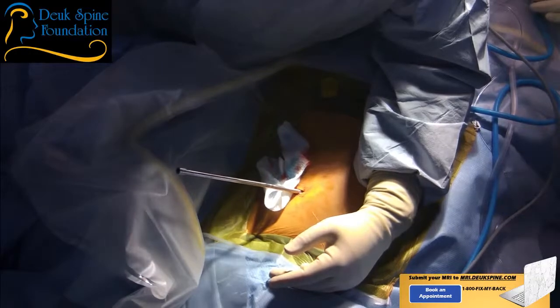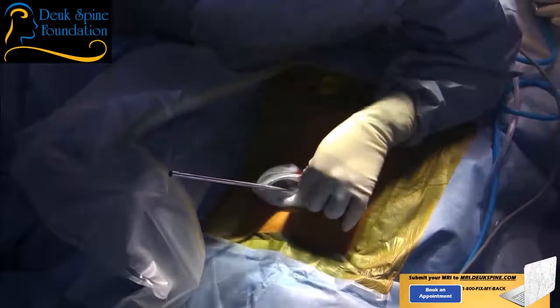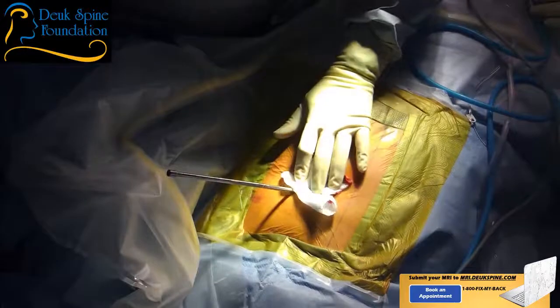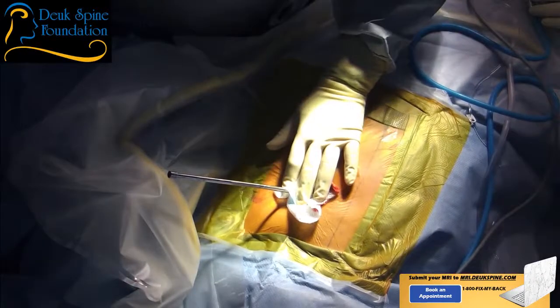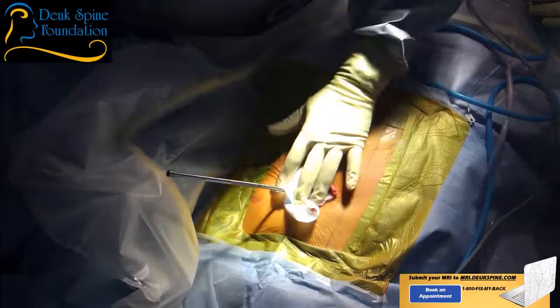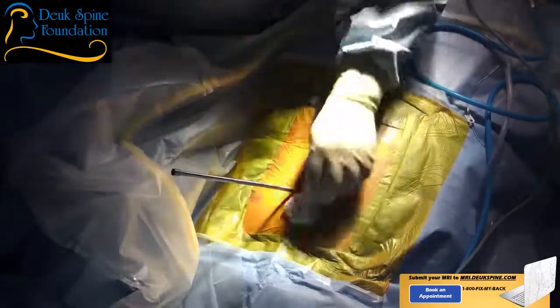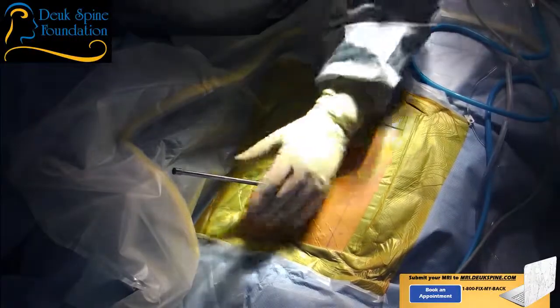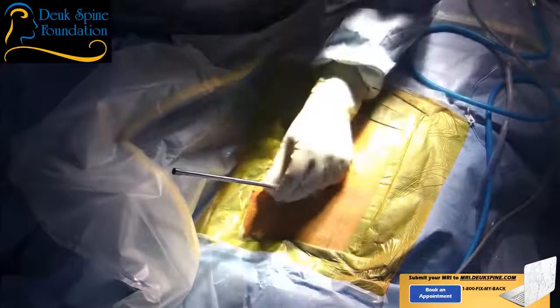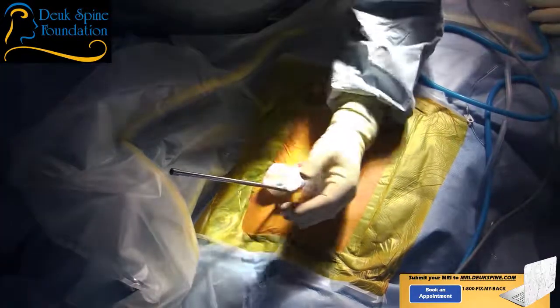Let me know when I should proceed. You're doing fine. Everything's okay, I promise. I'm sure he'll watch his surgery someday, but we know this disc was an 8 out of 10. Concordant, meaning it's his typical pain he gets every day. We just need to advance the tube into the disc. And once we've done that, we can get started on the surgery.